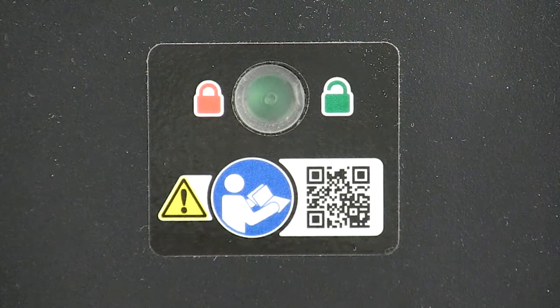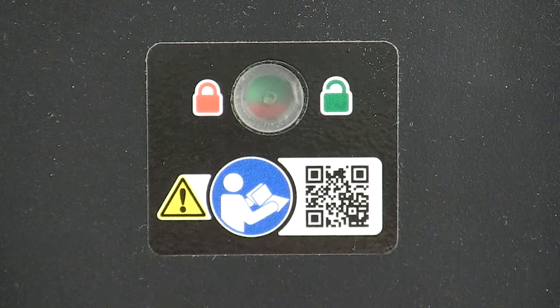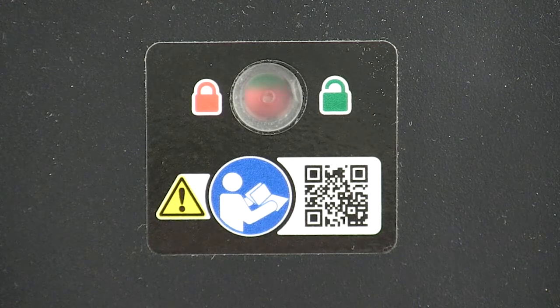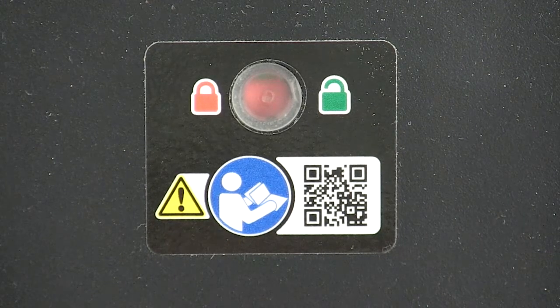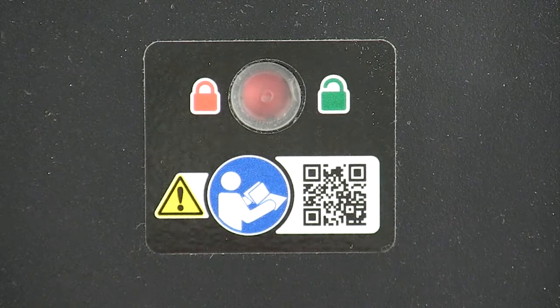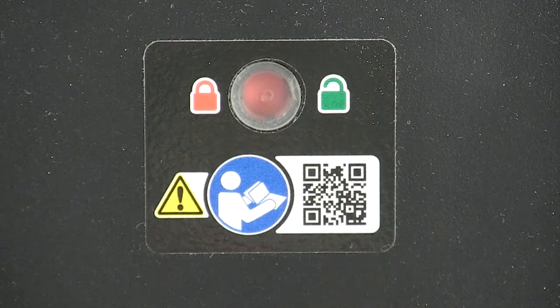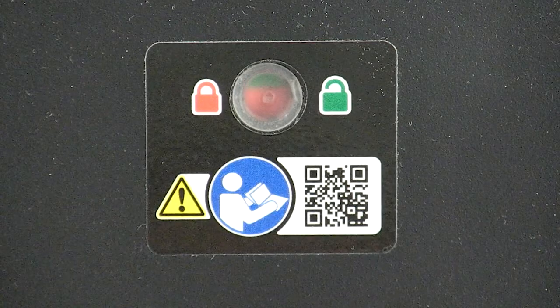The floor lock indicator window is located at the end of the fastening system and helps verify that the fastening system is secured to the vehicle floor. The indicator window is fully red when the fastening system is properly locked to the floor. If the indicator window shows any portion of green, which means unlocked, the fastener is not properly secured to the vehicle floor.